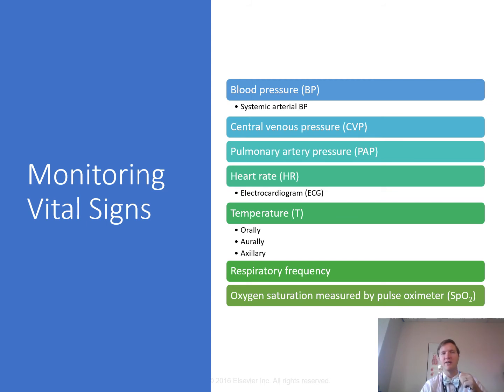So heart rate is going to be one of the first things that we'll look at here. Heart rate and ECG, usually they'll have an ECG on the monitor. It is a non-invasive way of continuously monitoring heart rate and their rhythm. All hospitalized patients receiving vent support must be continuously monitored with a 3-lead ECG. So the ECG provides minimum and maximum heart rate alarms, right? They're both audible and visible, and therefore they can alert any of us if there's significant bradycardia or tachycardia that occurs.